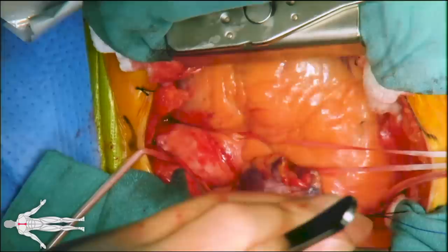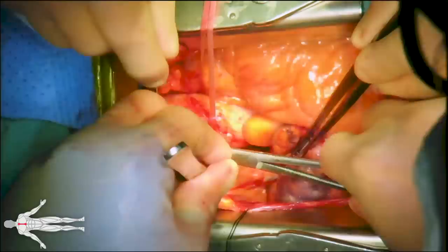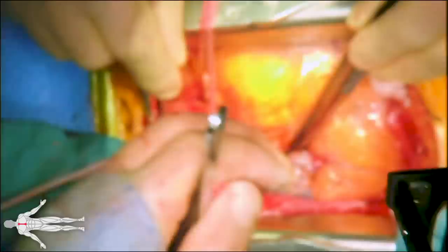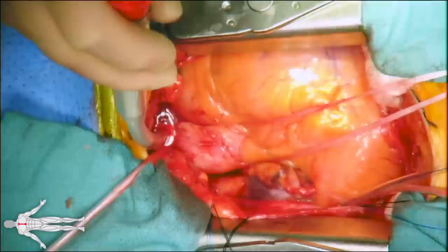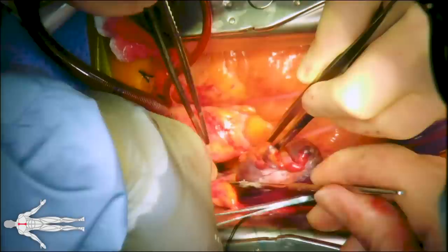Next, Ethibond sutures are placed at the base of the innominate artery in preparation for arterial cannulation for cardiopulmonary bypass. We then use Prolene suture to place purse strings around the superior and inferior vena cava. Prior to cannulation, the patient was systemically heparinized. The aortic arch is then cannulated and a venotomy is made in the superior vena cava.